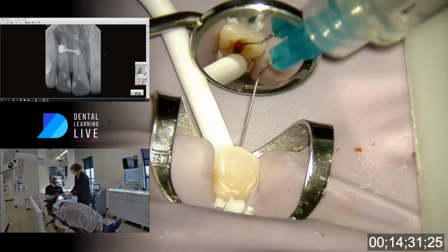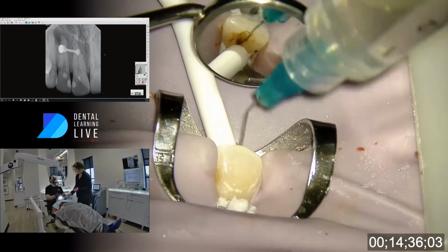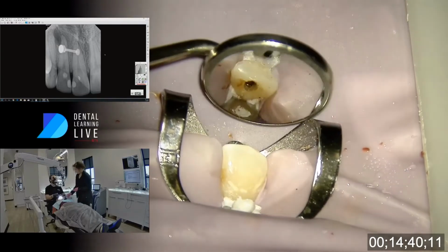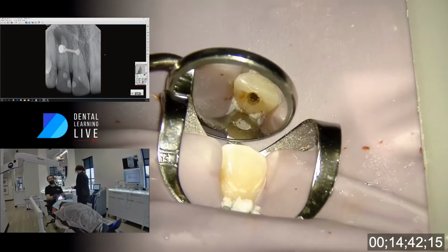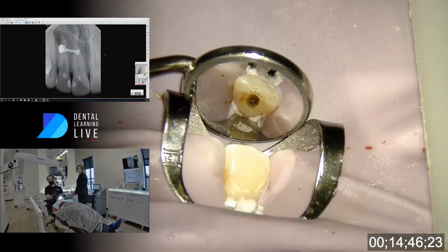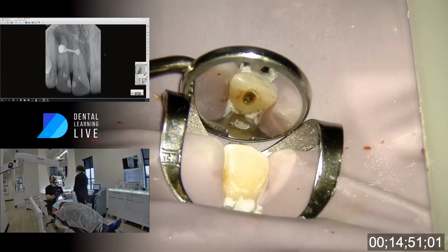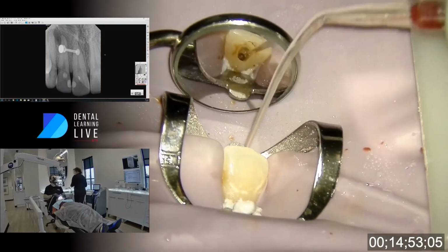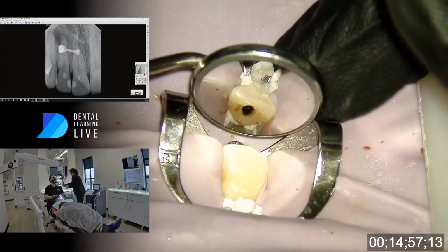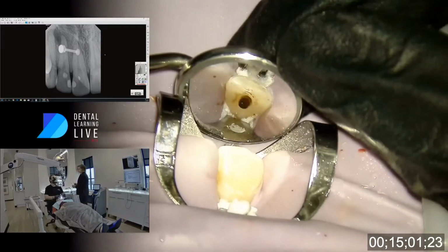She also has a kind of a lingual groove defect kind of naturally in this tooth, which is probably a big reason why this abscess is so large. So I'm just going to look directly straight down that. I know when I use the procedural instrument now, I'm going to be just directly parallel with that canal. That's kind of my logic. There are size parameters, and we'll show you that when you get to the platform of what that should look like.